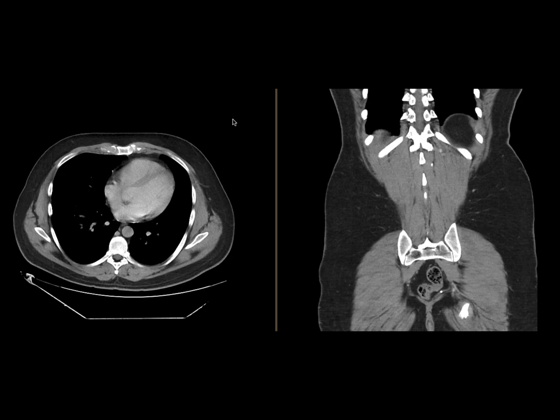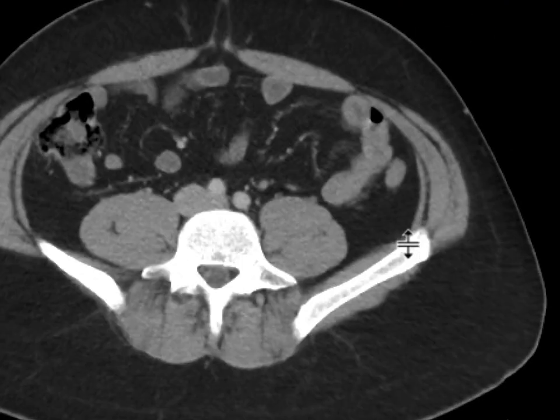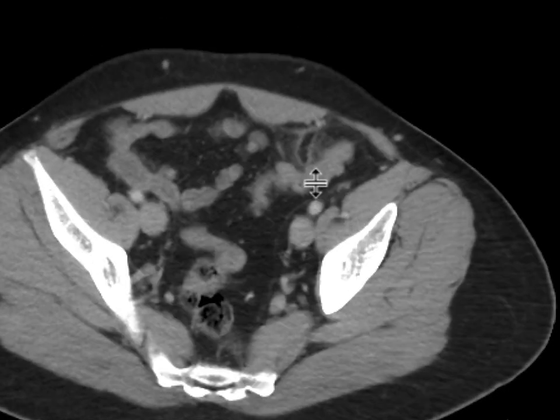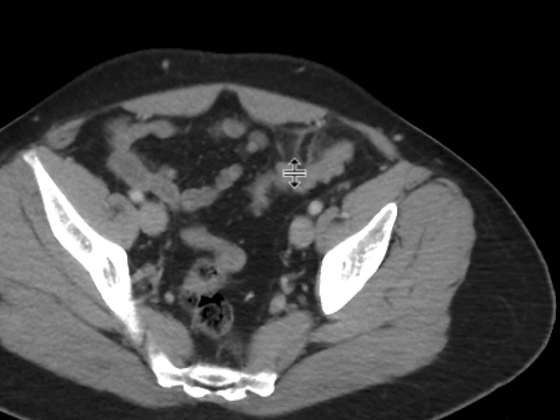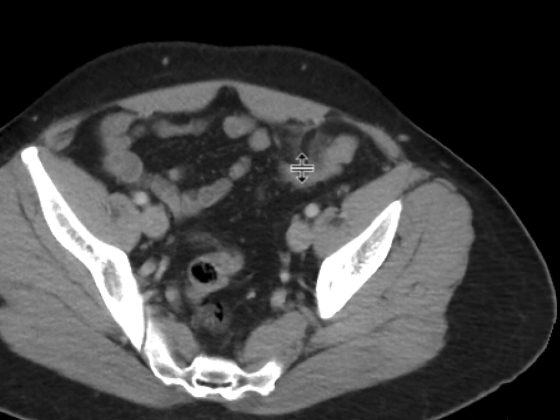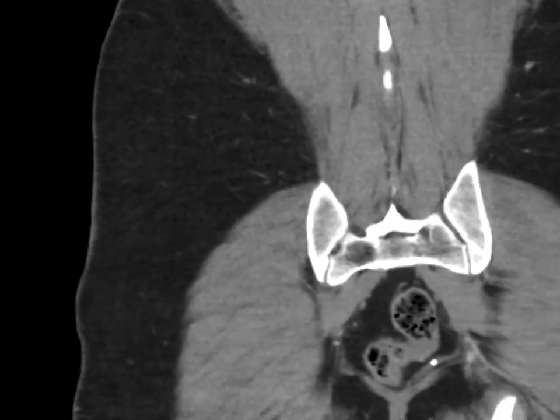This is a patient with a recent right inguinal surgery who comes with left lower quadrant pain. If you scroll down, we can see that the inflammatory change is in the left lower quadrant, characterized by a somewhat oval-appearing mass composed of fat-containing tissue centrally. There's a hyper-attenuating rim to it, with a little bit of inflammatory change associated with it. It's adjacent to the sigmoid colon, but the inflammatory change doesn't appear to be arising from the sigmoid colon.